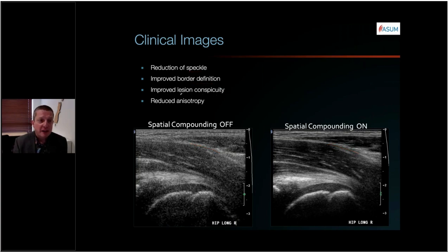If we are looking for any sort of focal liver lesion, focal liver lesions are also much better visualized, and that would be the same for lesions in other organs, for example, kidney, as well as normal anatomy, for example, during obstetric ultrasound.